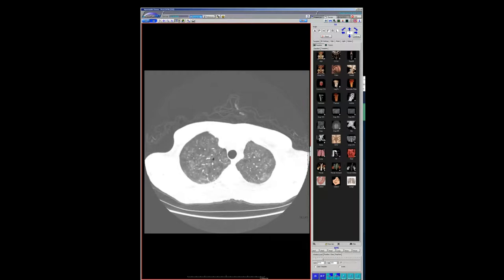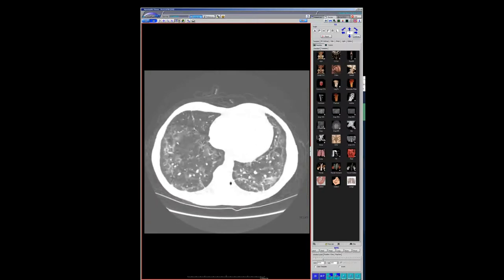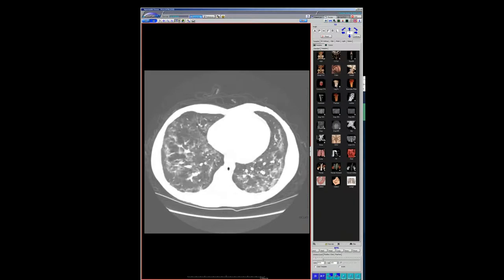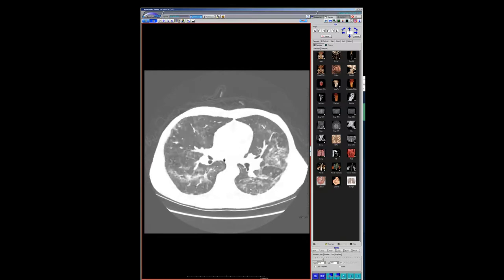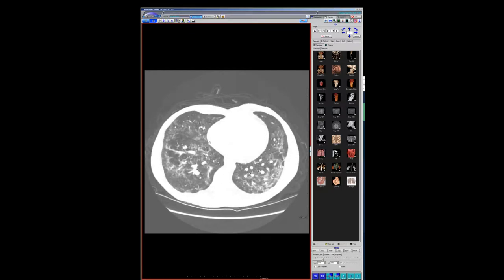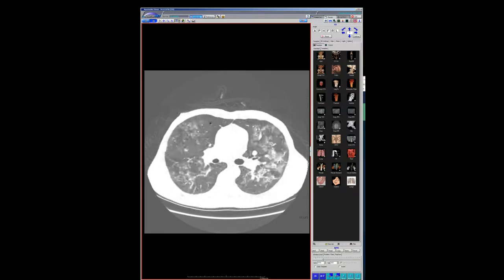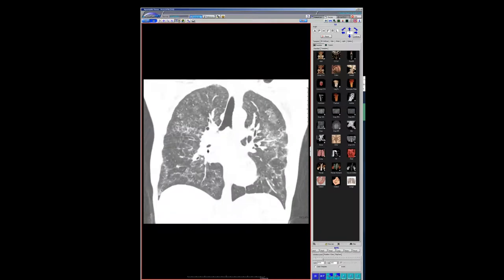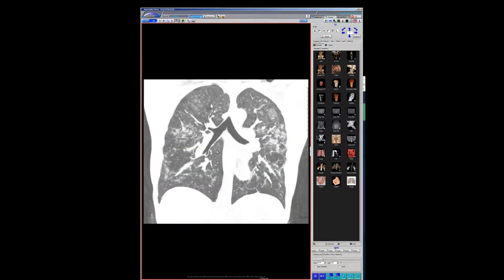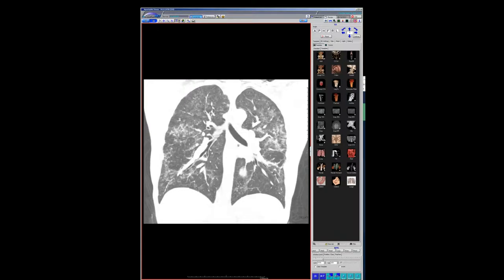This guy has the upper lobe nodules, the more nodular appearance, and the lower lobes could be just organizing pneumonia. He was smoking THC and marijuana products and then immediately improved on admission of steroids. So this was an EVALI case. To Jeff's point, the CDC stopped updating their totals in mid-February, on that same page where they have the curve. Also, I've heard that now there are questions of vapers coming in with COVID symptoms in New York. I think it's great that you showed this because it's not completely gone and it's just going to cloud the picture for some patients more.